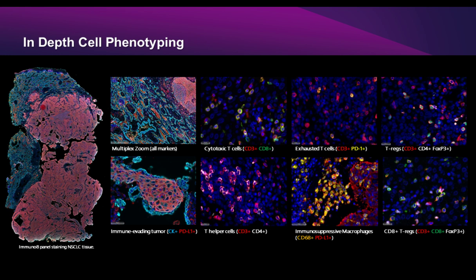And I'm sure Katir will talk a little bit more about this, but with the Ultivue technology, each channel is spectrally separated sufficiently where you don't see the spectral overlap. So unmixing is generally unnecessary.